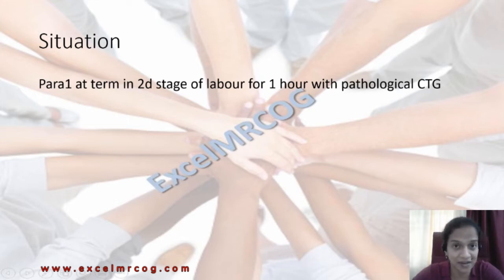It may not be enough to say I would apply an instrument or I would shift for cesarean section depending on PE findings. That is what comes to your mind, right? But it may not be enough because there are certain things that the NICE guidelines lay down that you would need to say in the exam in order to score the full marks.